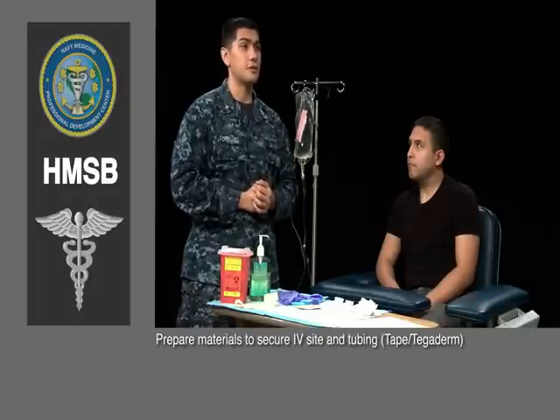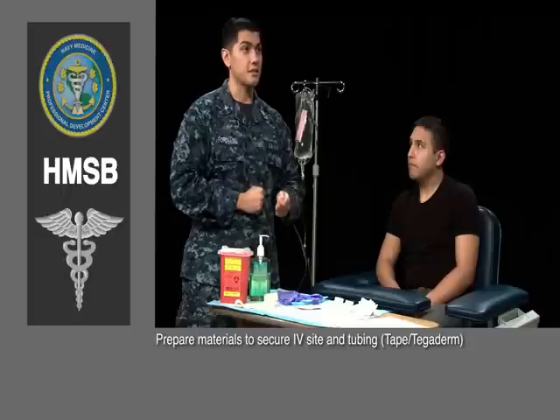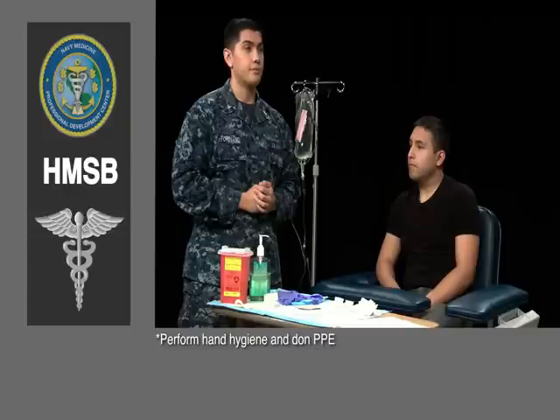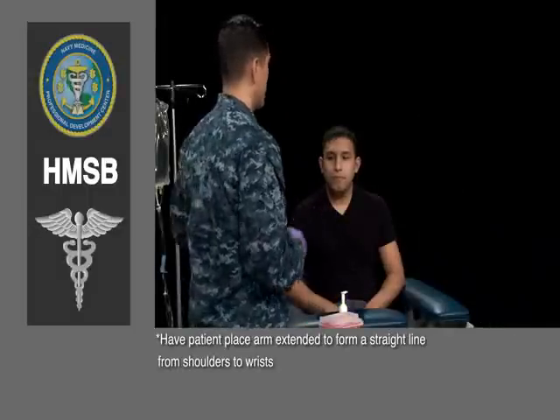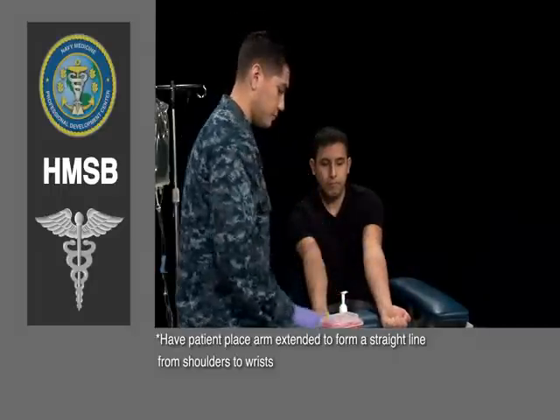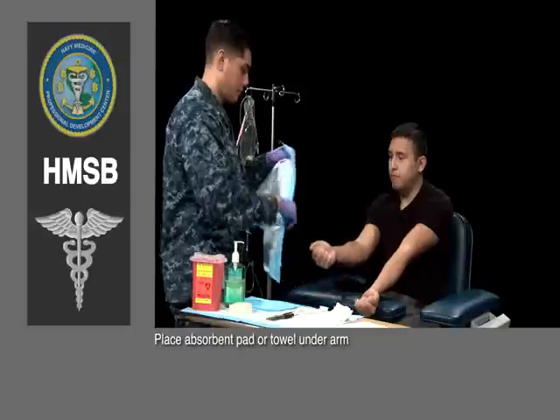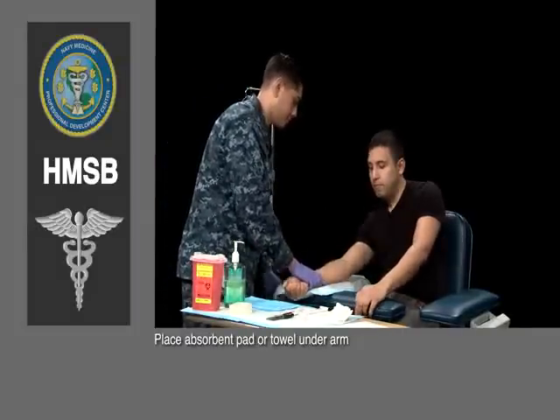In preparation for securing the IV site and tubing, I need to have my transparent dressing and tape at the ready. I will again perform hand hygiene and don clean gloves. All right, sir, now can you extend both of your arms for me? Yep. Okay, you can relax this arm.